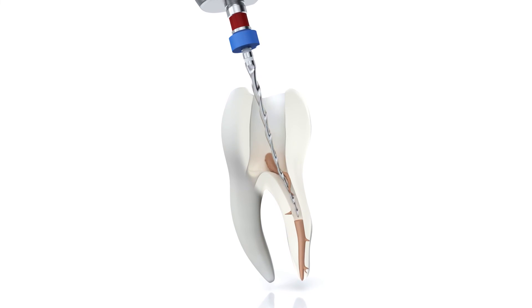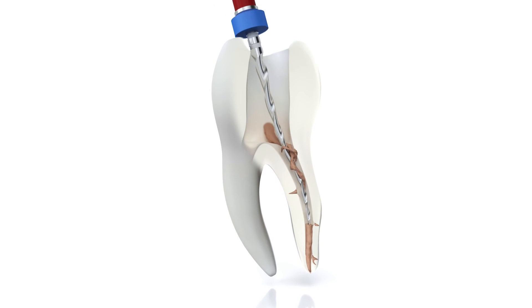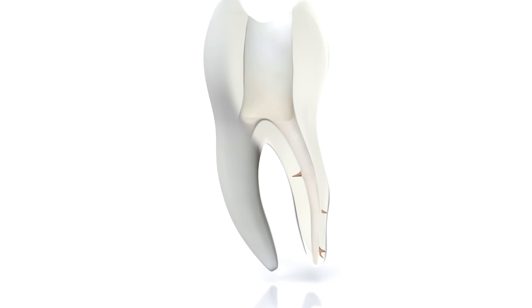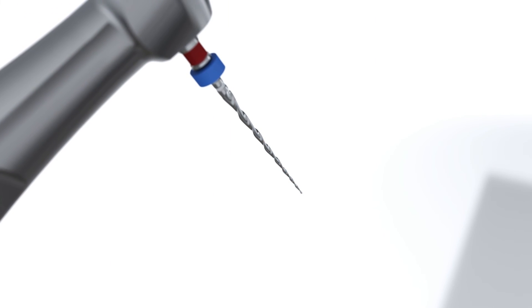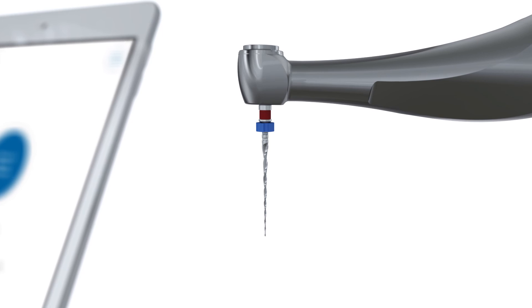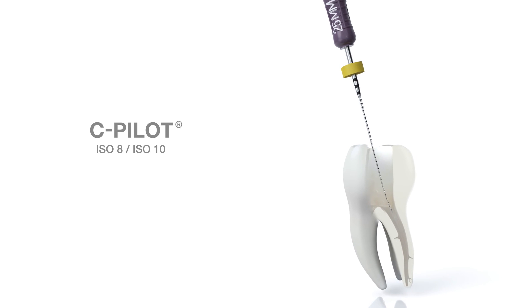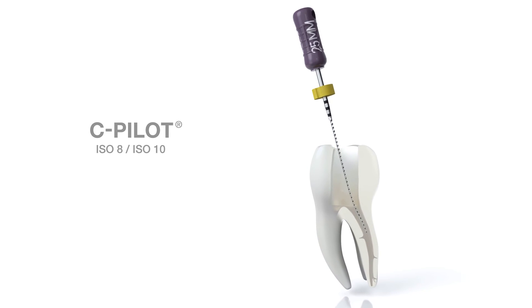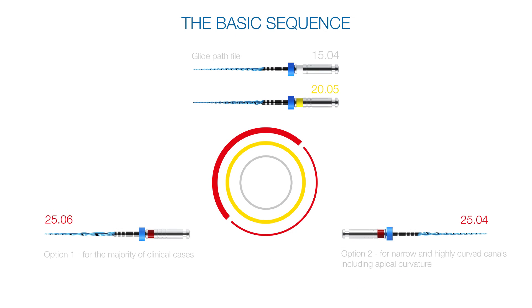Gradually remove the root canal filling with circumferential filing movements. Clean and inspect the instrument's cutting flutes throughout the re-treatment procedure. If deformation is observed, discard the instrument and use a new one. Use an ISO 8 and afterwards an ISO 10 hand instrument, such as a C pilot file, to prepare the root canal to full working length. Continue the preparation with the VDW rotate basic sequence using the same procedure as previously described.